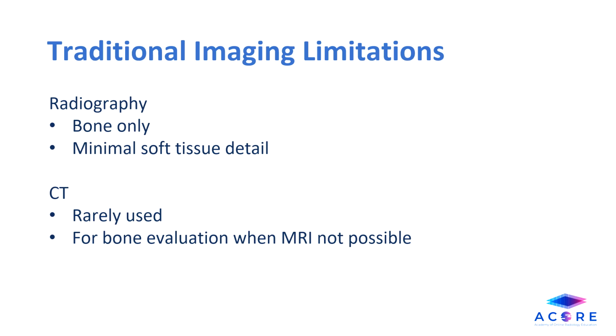CT is rarely selected for the initial modality when evaluating for a nail pathology, but it can definitely help identify subtle bone involvement in patients who are unable to receive MRI evaluation.